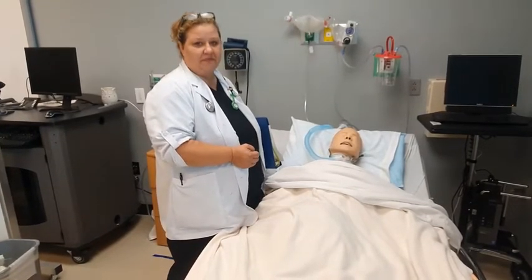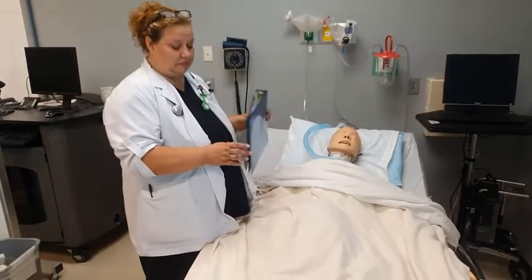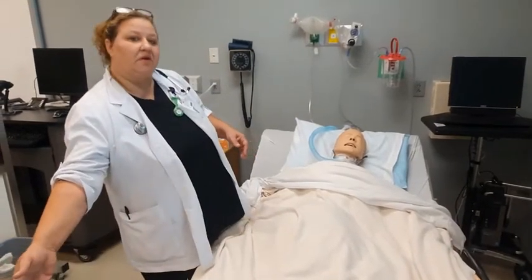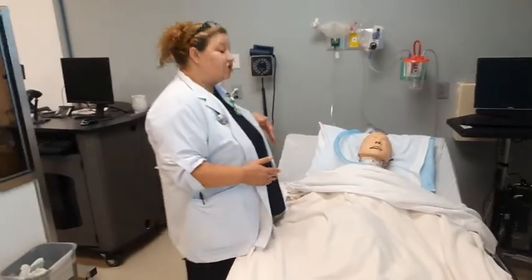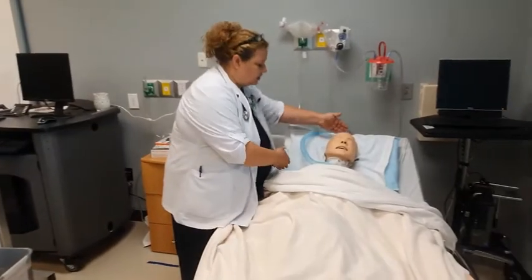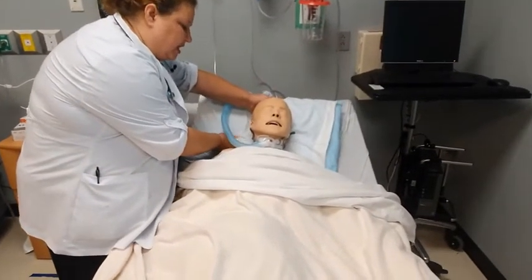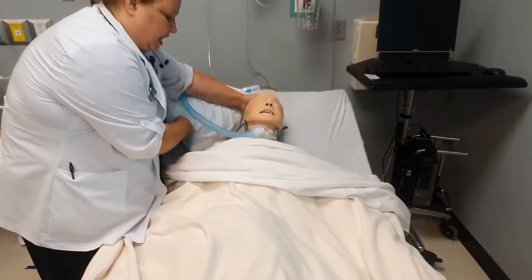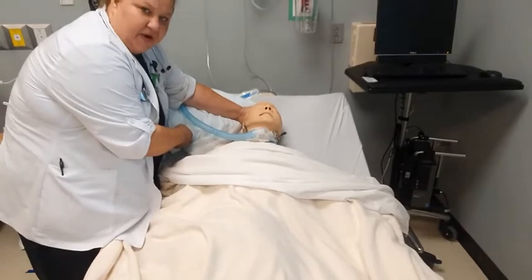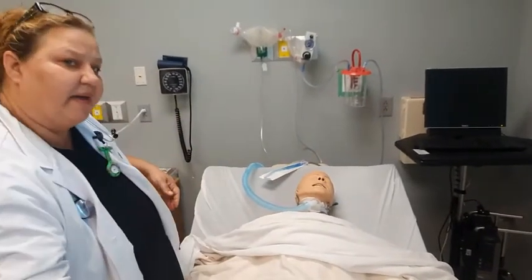Make sure privacy is provided. Position your client in semi-Fowler's and remove the pillow to slightly hyperextend their head. This is a private room, so the patient already has the privacy. To hyperextend the patient, what you'll do is say, "Hey, Mr. Smith, I'm going to be removing the pillow from your head to get in preparation for us to be able to do the care that we need." And that hyperextends it right there, okay? You take the pillow and you can put it down at the foot of the bed.